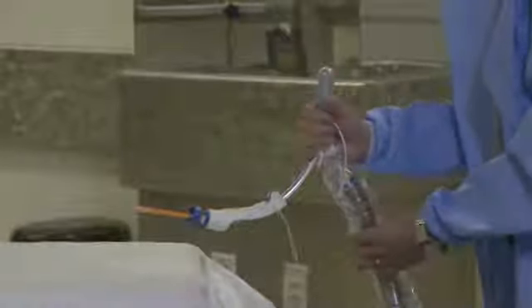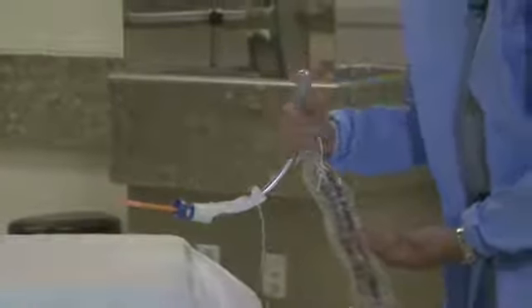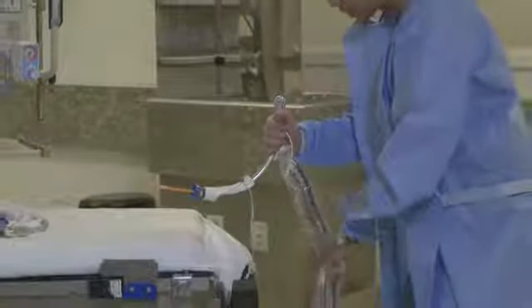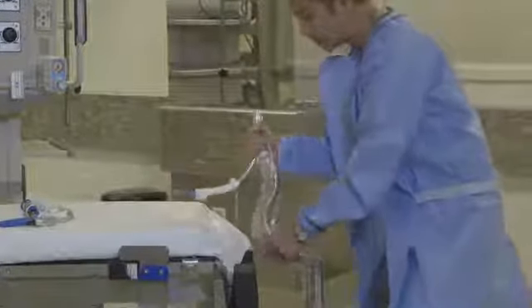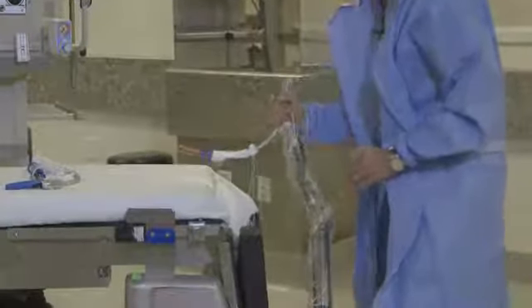You want to be able to hold, and I tend to hold both the handle of the uterine manipulator as well as partly the clamp here, because it gives me better control. But I also take my other hand and I use this to adjust what I call the gooseneck component of the ALI UPS. And that allows me to get greater flexibility and range of motion, which I get a lot easier than just doing it with one hand.